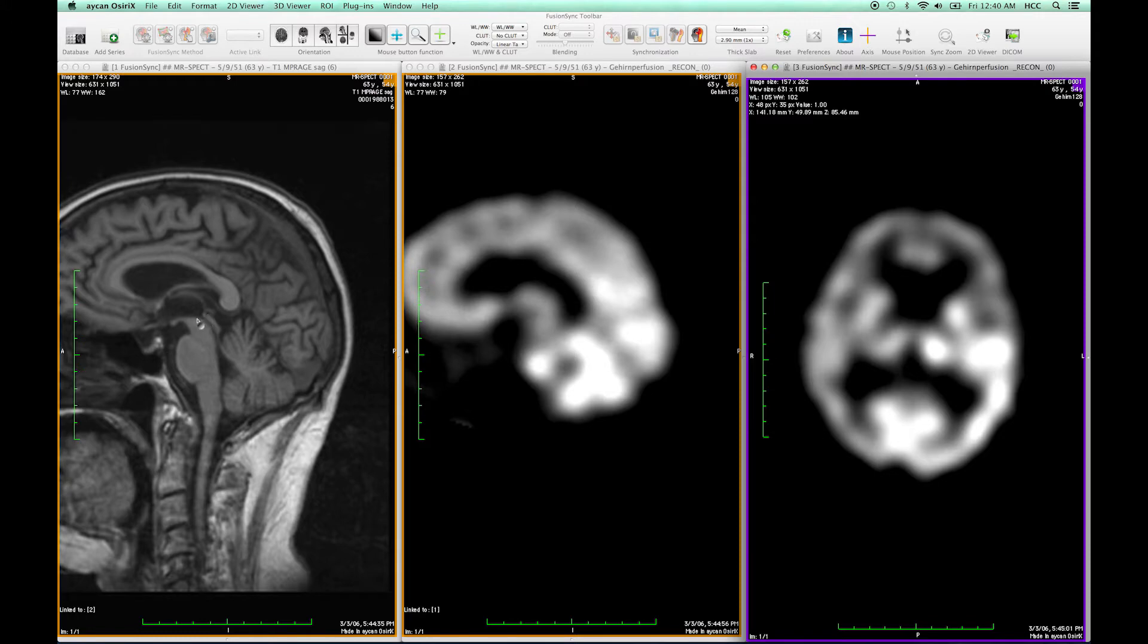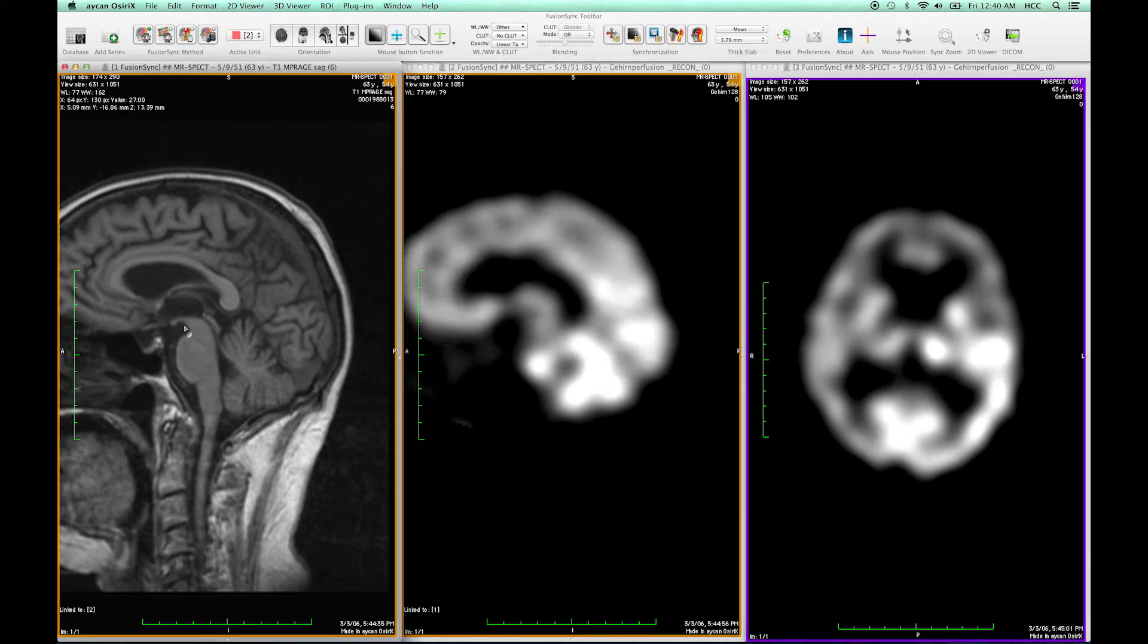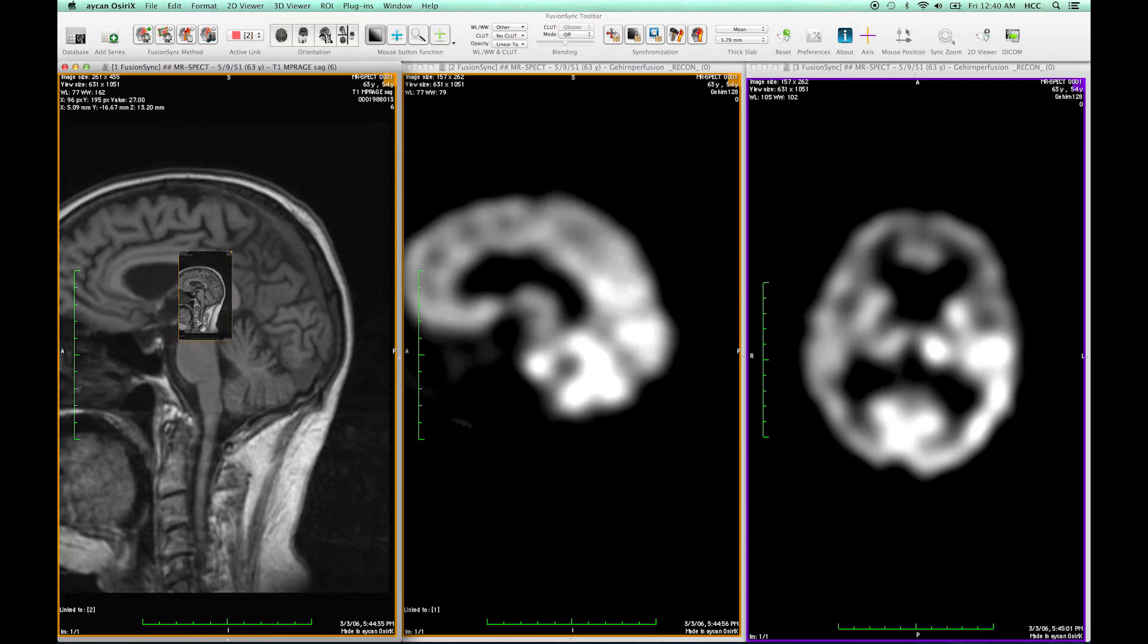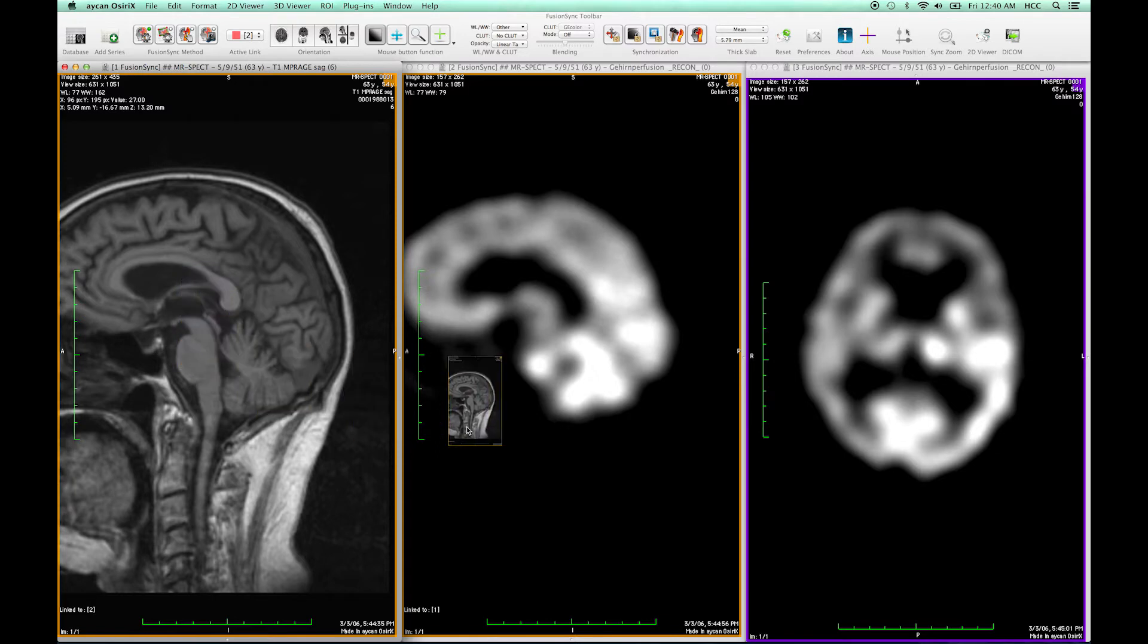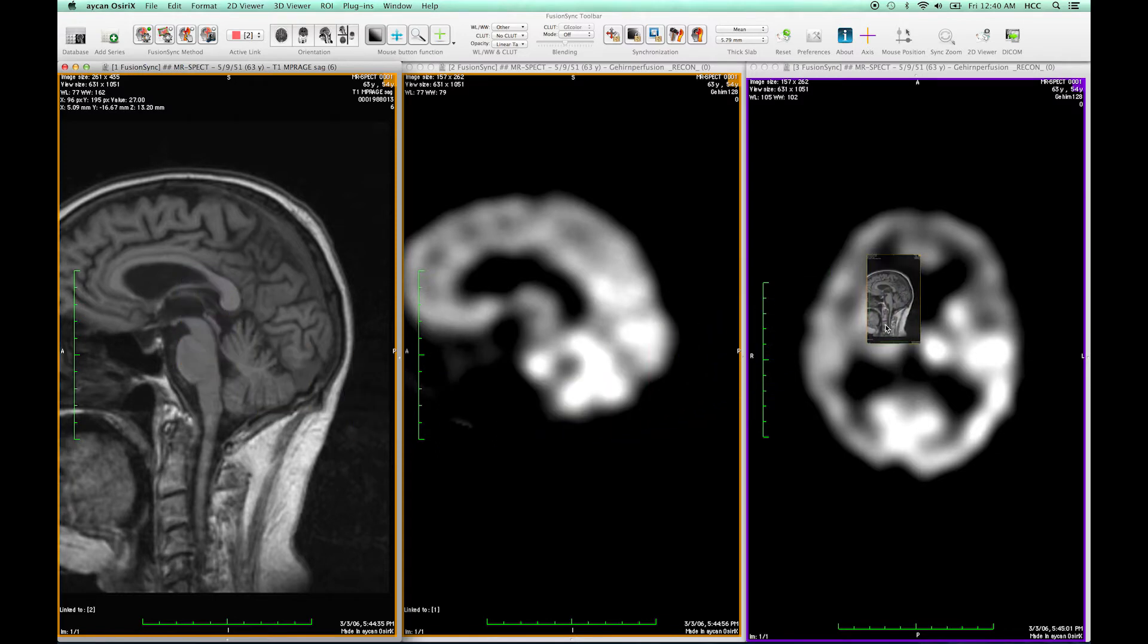I can establish a manual link by pressing the left mouse button in the reference view and wait until the small view icon appears under my cursor. This icon can be dropped on top of the new image and this establishes a new link.